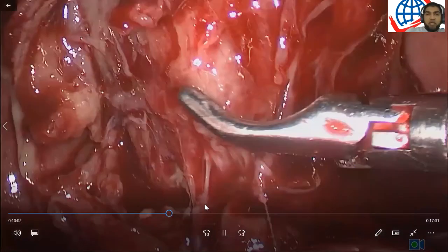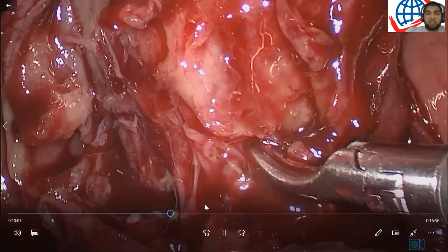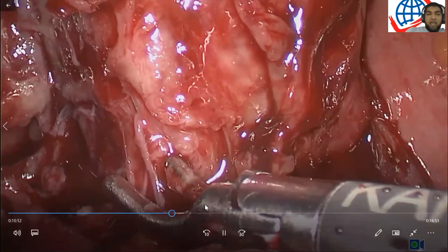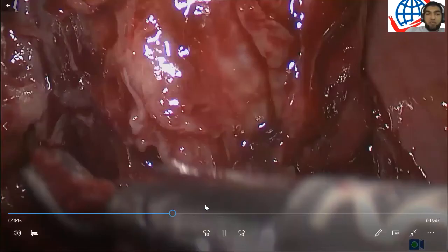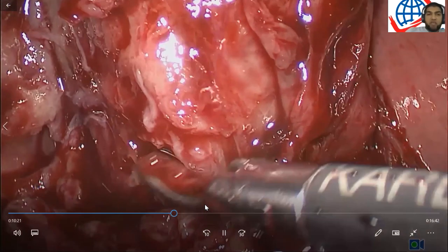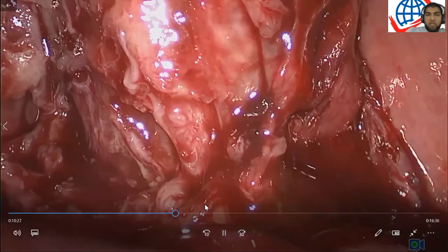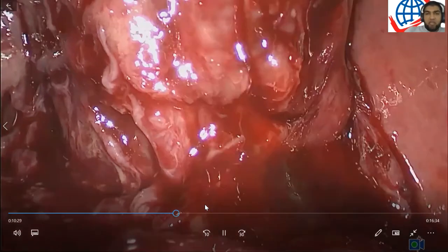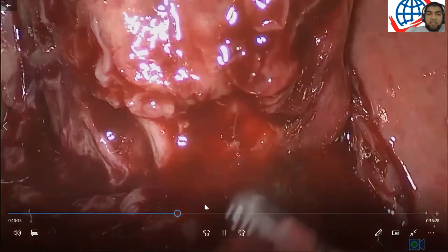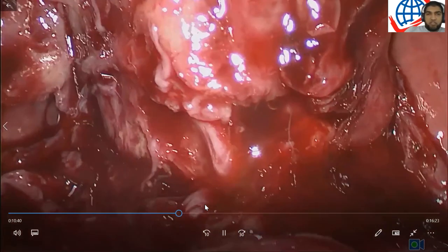And if you are hoping to find that critical view of your cystic duct and your cystic artery, and you're not aware of your various landmarks, and as to staying high with your dissection, you can get into serious trouble in a case like this. So as you can see here, we're sticking onto the gallbladder gently with the back of the instrument, trying to push things downward. We're not digging down in the area where the common bile duct is. We're staying high. And when things start to make sense, then we can start going for those structures.